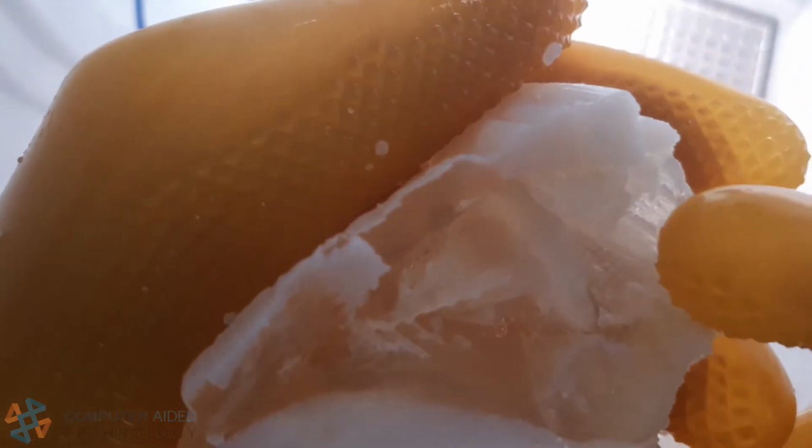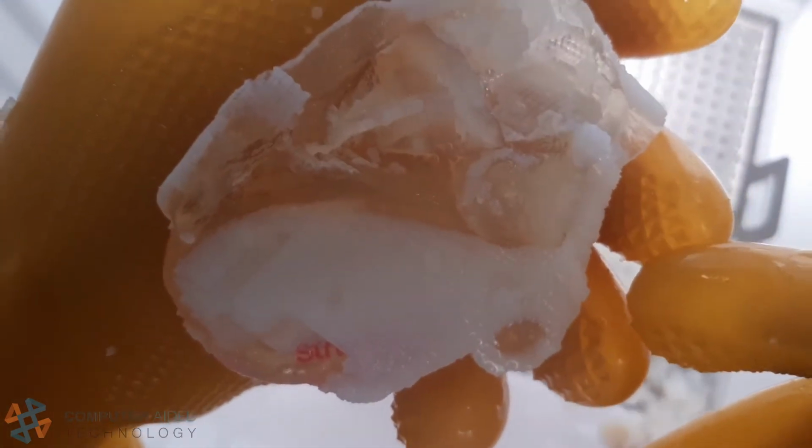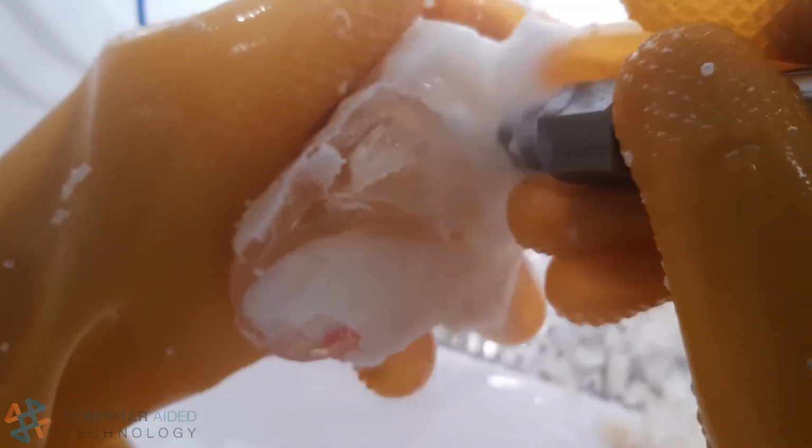You can see here that there is a microstructure. You can see this little rectangular patch. That's the little microstructure of pockets of gel support. As I wash that out, the gel support goes away with low pressure water.